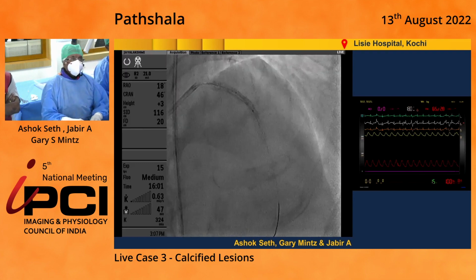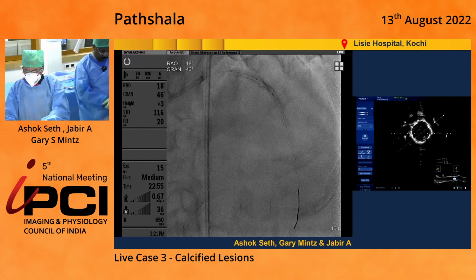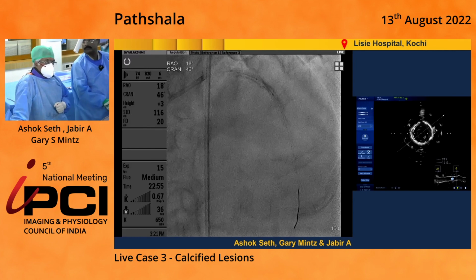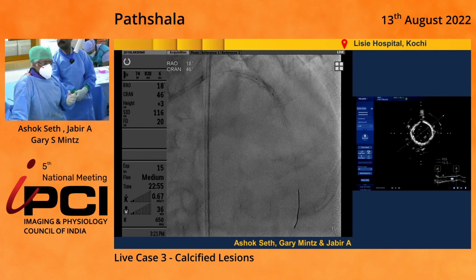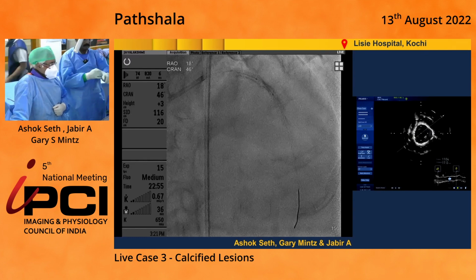Yeah, we can see it, Ashok. So let's just show you what we've done. We fired our 80 pulses, 8 cycles at the lesion. Let me just show you a couple of pictures. We've done it eccentrically, as I said.